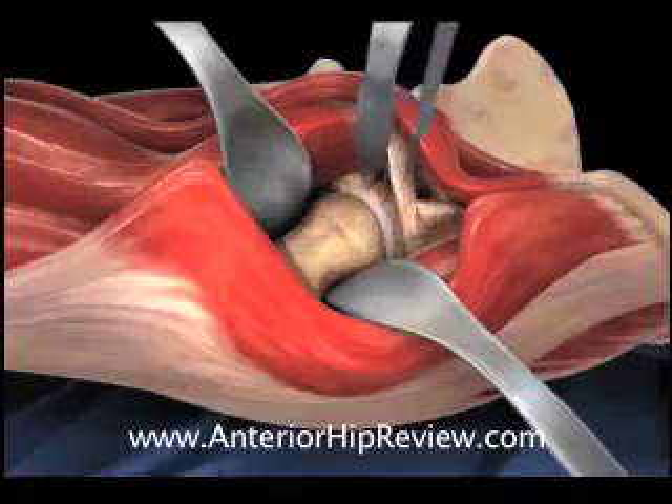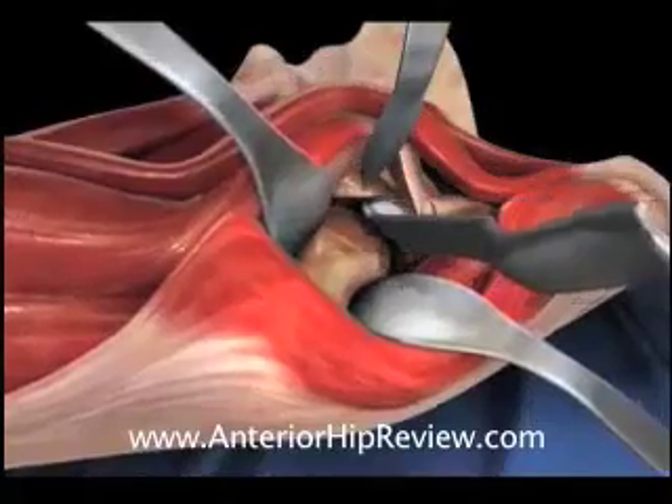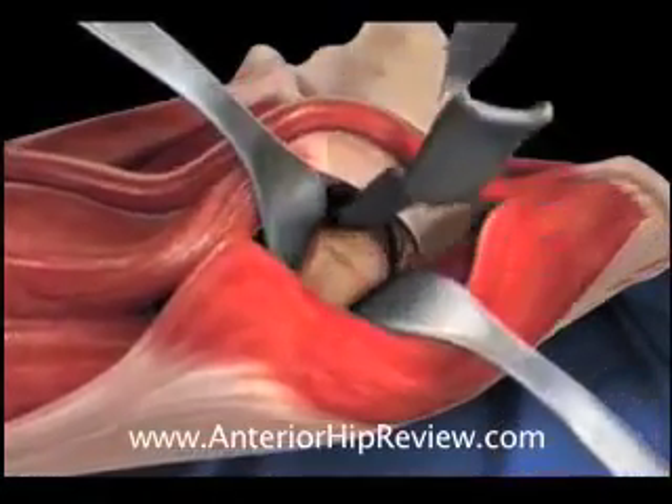At this stage, the hip can either be resected in place, or it can be dislocated prior to making a femoral neck cut. In this animation, we demonstrate dislocation of the hip prior to making the femoral neck cut.